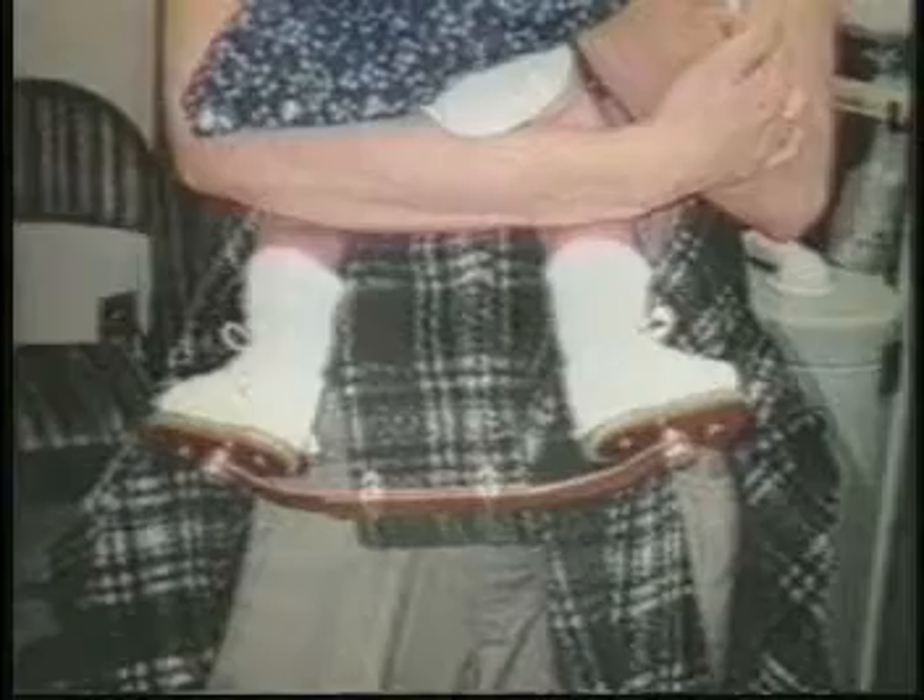Three weeks later, the casts are removed by their doctor. There are no scars on the corrected feet. A foot abduction brace is worn for three months full-time and for three years whenever the baby sleeps. At six and a half months of age, Isabella's feet look normal. The feet are limber.